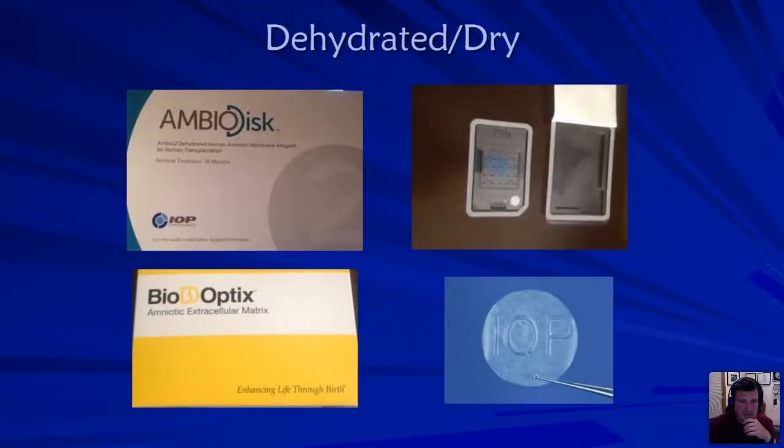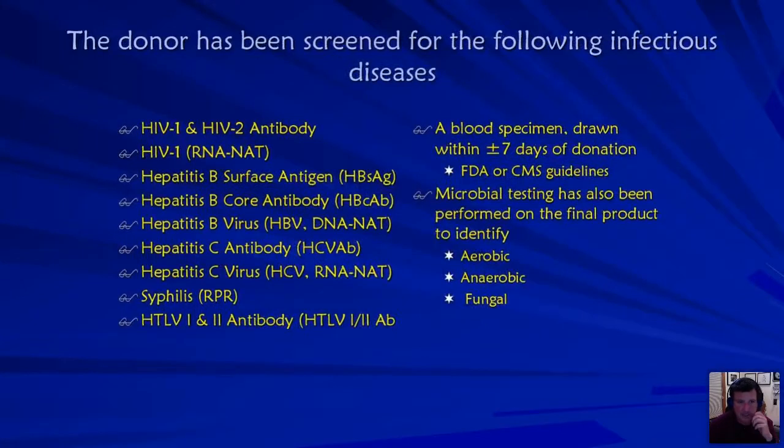Again, dehydrated, you have to know which side's up, and you have to be real careful when you wet it. It can really curl up pretty quickly.